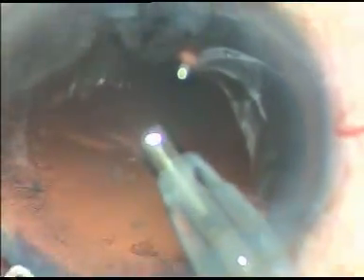This is the last fragment — we must be very cautious while emulsifying this. I decrease the vacuum; at this time I come to phaco-on position and increase the bottle height if it is less. The nucleus is taken out.